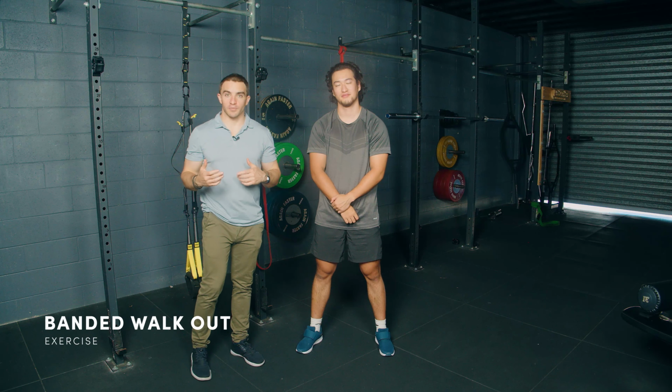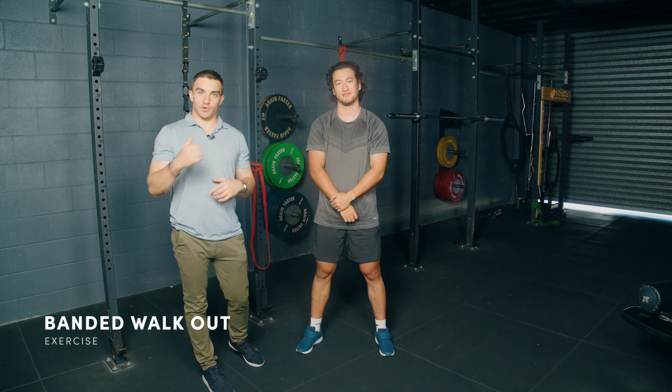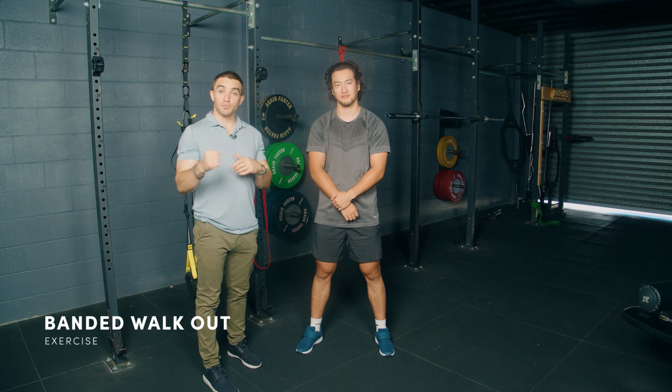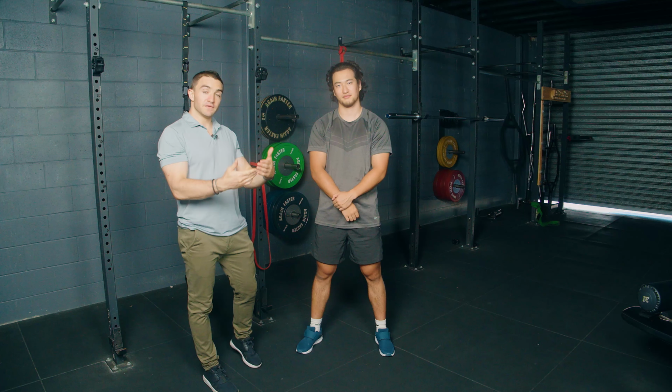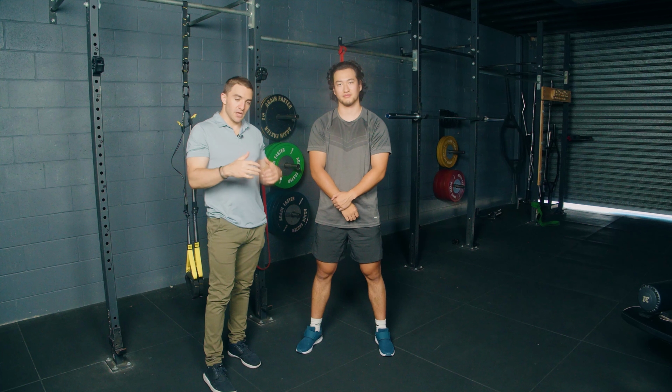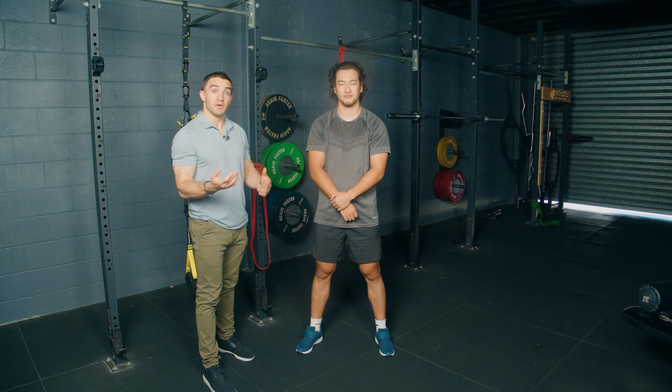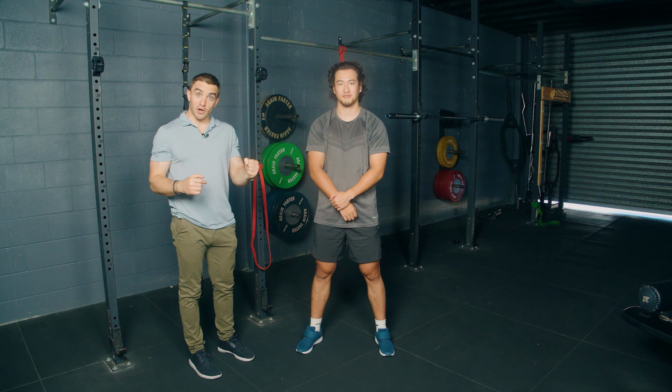So we spoke earlier about giving the patient feedback about their force expression by using a Dynamo, placing it on their wrist, and having them push into a fixed surface and giving them feedback of how much force they're producing. But when we want to progress our isometrics, we'll start to get into some of our gym equipment. So I'm a big fan of just using your standard isometric walkout with a band.